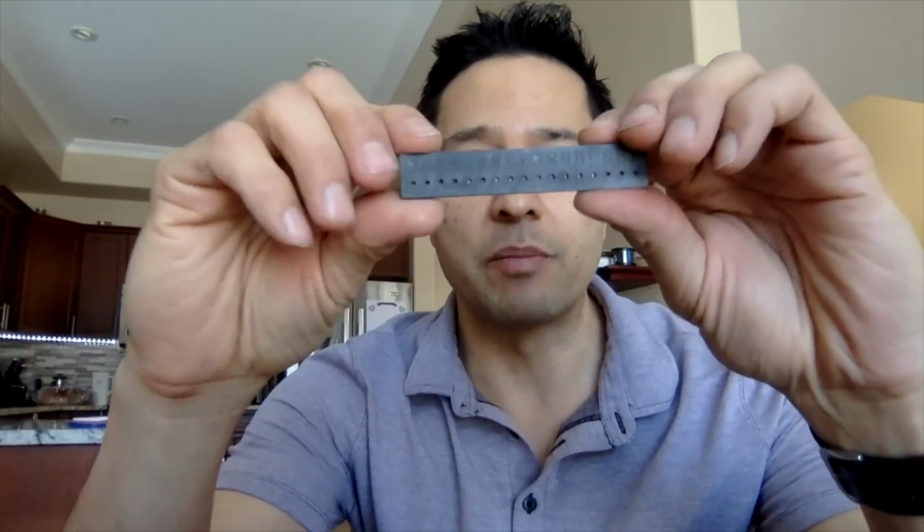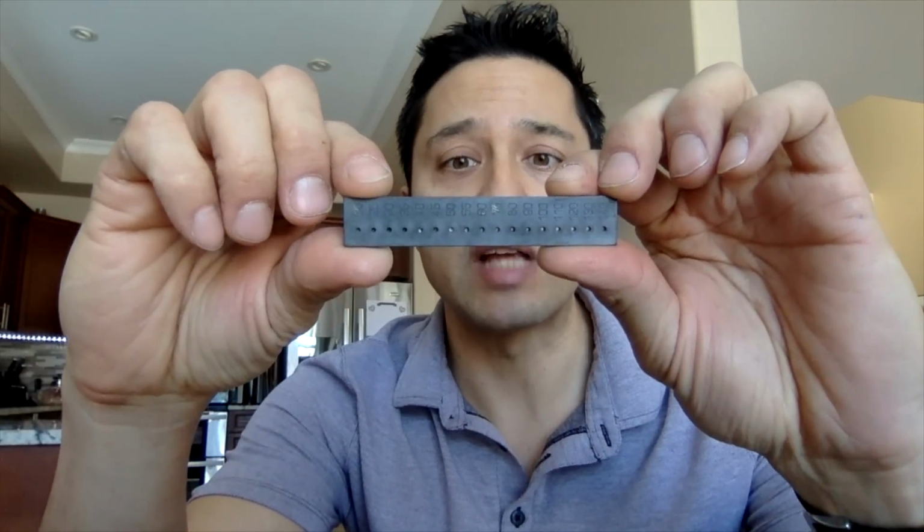And you know what? The last question I have is, where did it go? I have it in my back pocket. Have you seen one of these guys? And if you have, put it in the comments. Let me know how you use it, what it's for. It's for endo and for gutta percha. And this is one of my standard instruments and the technique that I use.